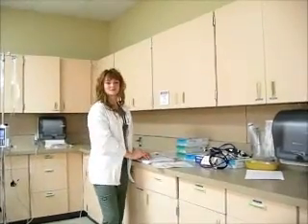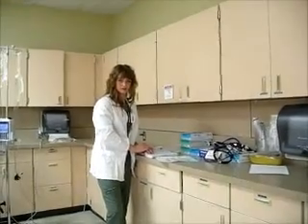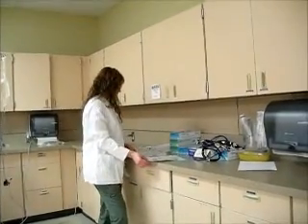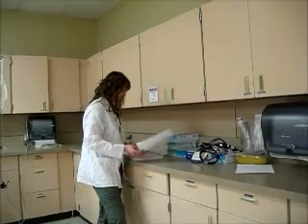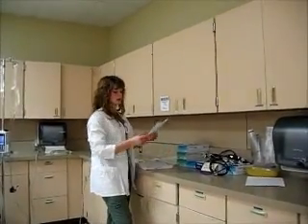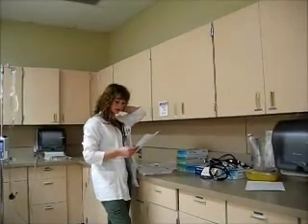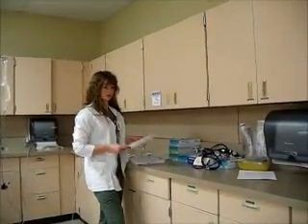Alright. My name is Lillian Erickson, and this is a video for health assessment professional skills. My patient here is named Pat Smith, and we have a new order for regular insulin, 8 units IV bolus, stat, and then to follow with regular insulin infusion, 8 units per hour.